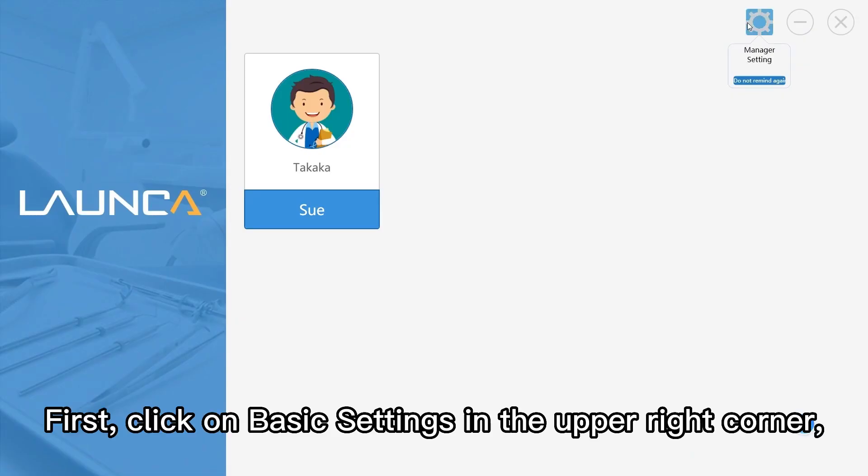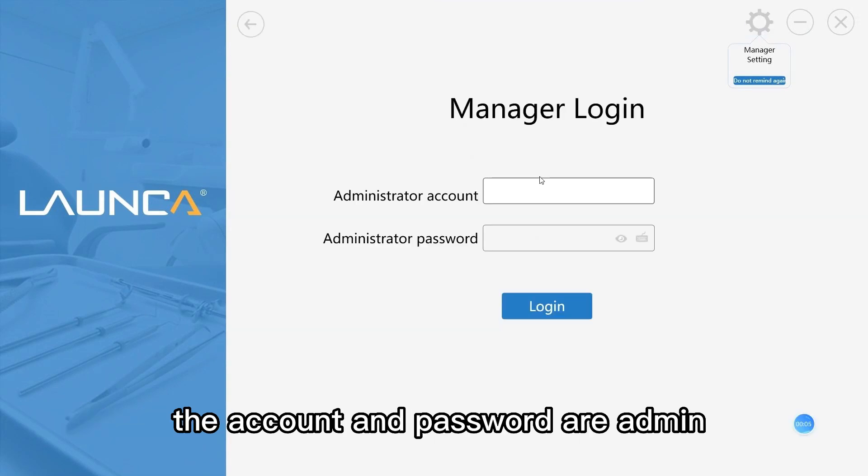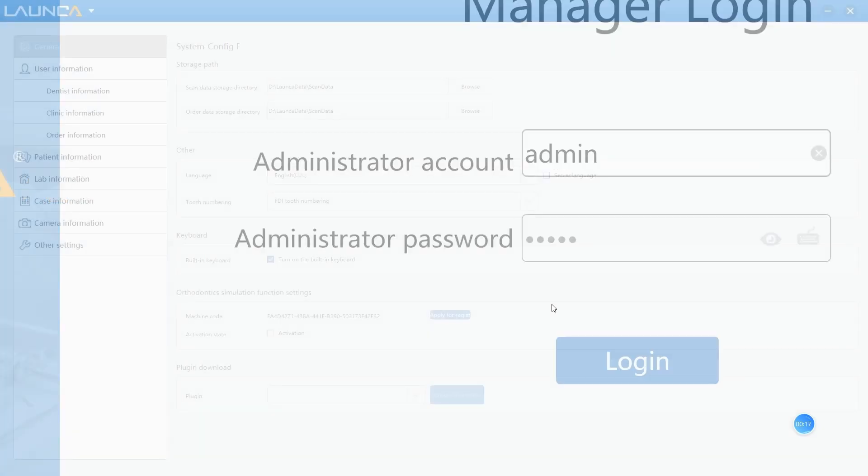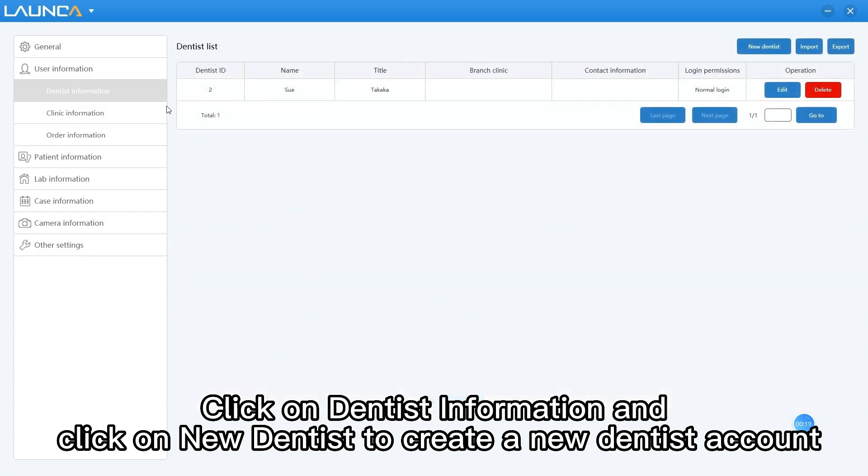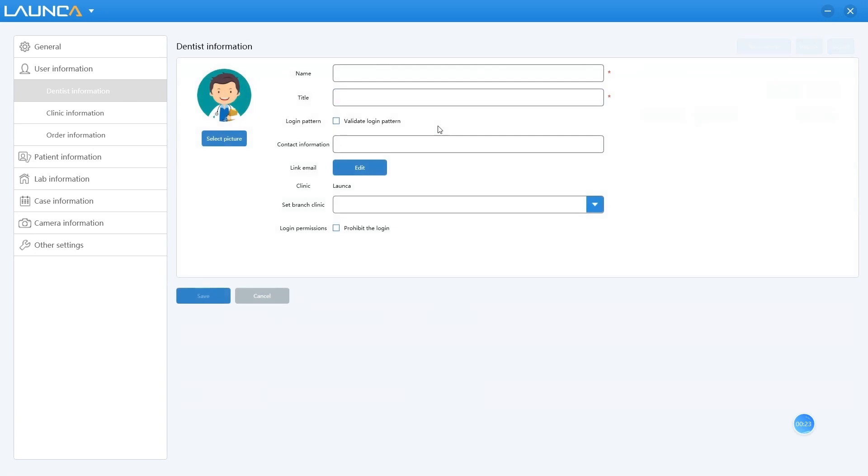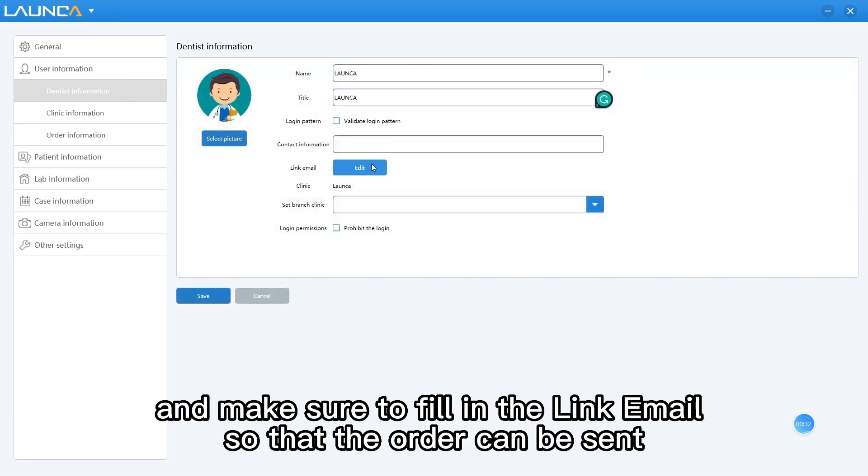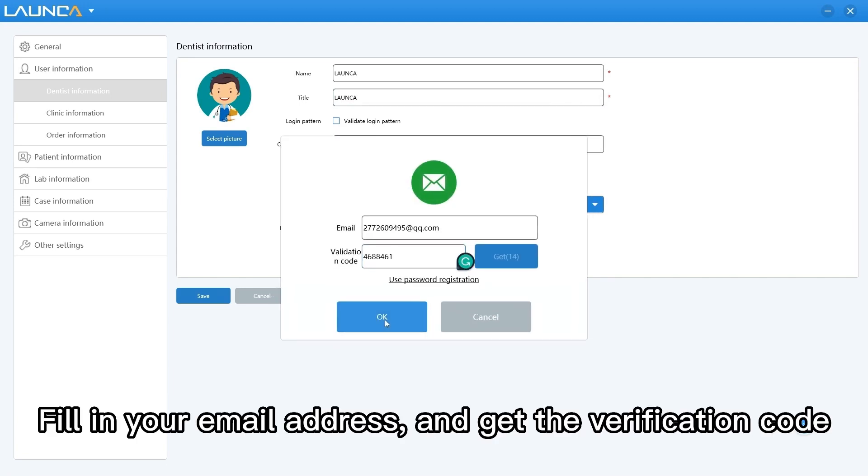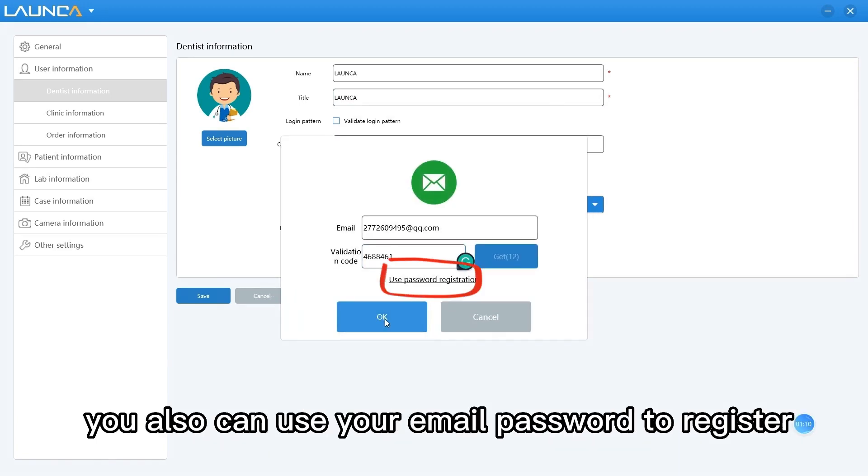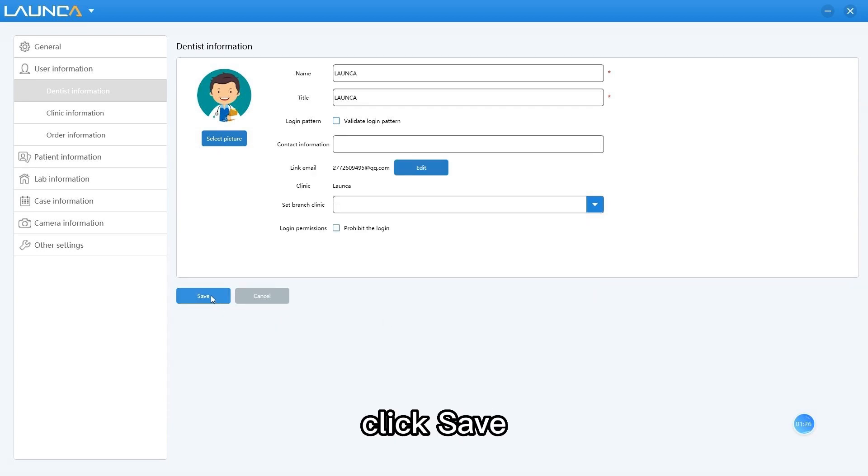First, click on basic settings in the upper right corner. The account and password are admin. Click on dentist information and click on new dentist to create a new dentist account. Fill in the information and make sure to fill in the link email so that the order can be sent. Fill in your email address and get the verification code. You also can use your email password to register. Click OK.